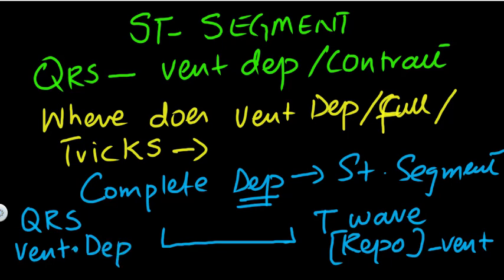So this here is your ST segment showing complete depolarization. I'm just going to write CD, C dep. Okay, so ST segment.